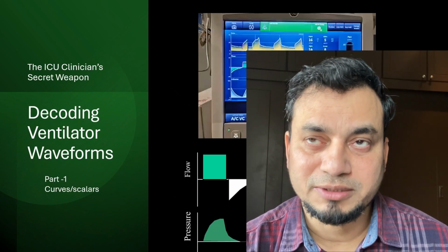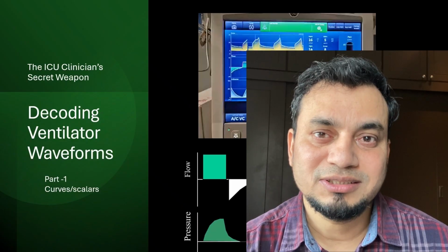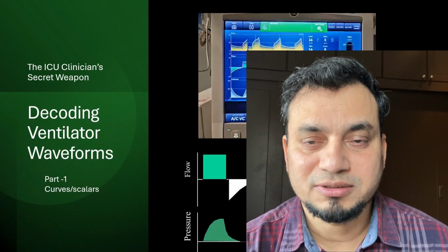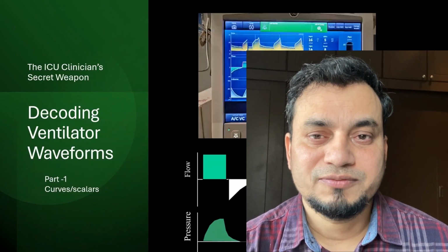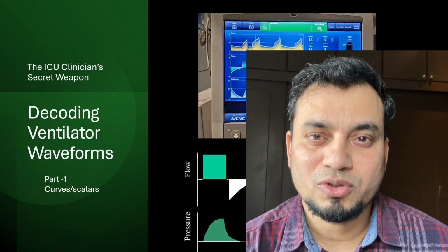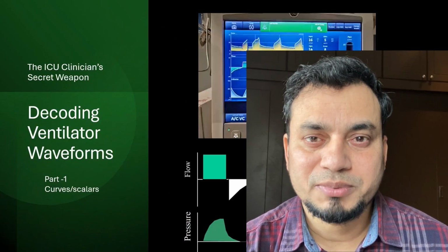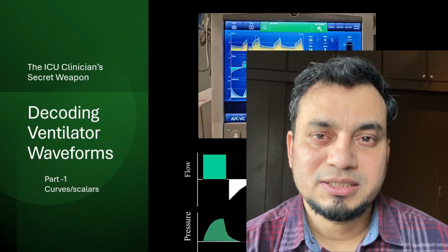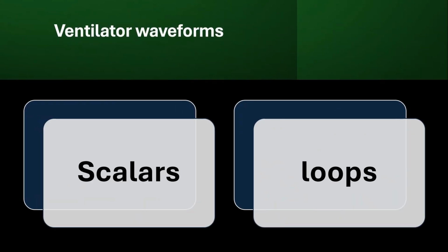These videos are not only for doctors, but also for senior nurses, experienced intensive care nurses, respiratory therapists, emergency physicians, and technicians who have first-hand knowledge of ventilators. All those health personnel who work with ventilators will get most of the benefit from these videos. So simply, ventilator waveforms can be divided into scalars and loops.